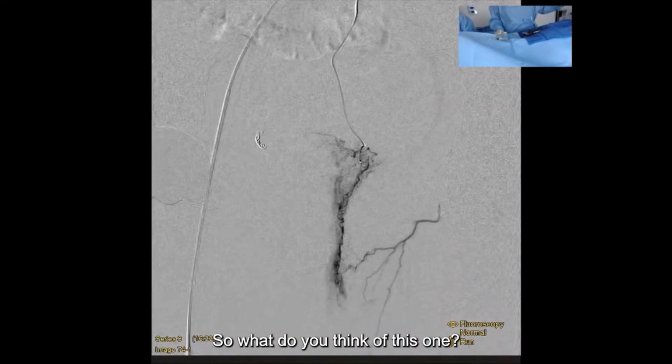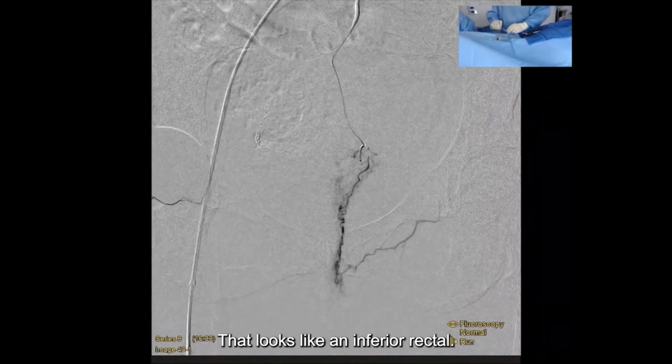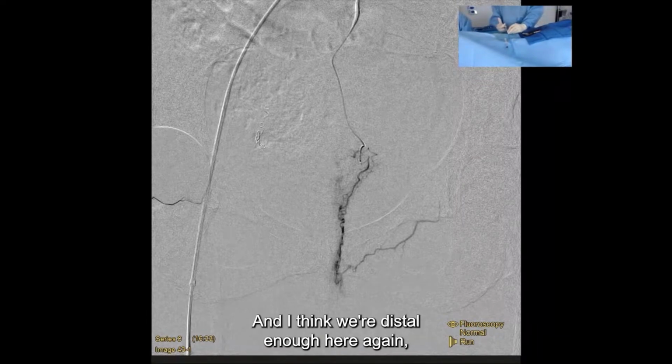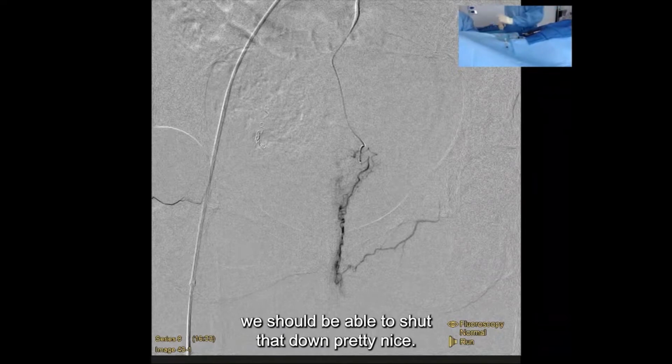Exactly. So what do you think of this one? It's nice. You're really seeing a good anastomosis there. Exactly. That actually looks like an inferior rectal. So that looks really nice, and I think we're distal enough here. Again, if we get beads in here, we should be able to shut that down pretty nicely.